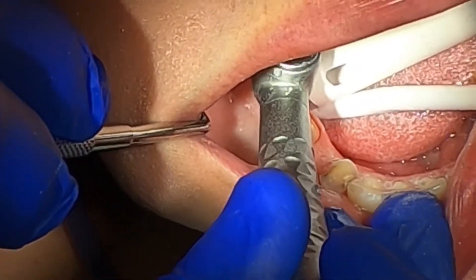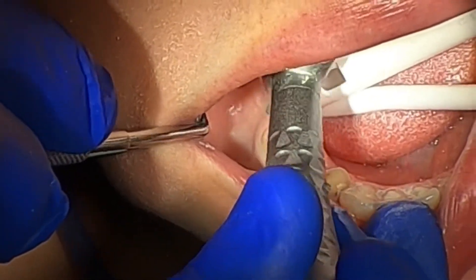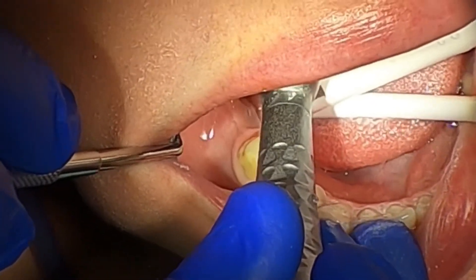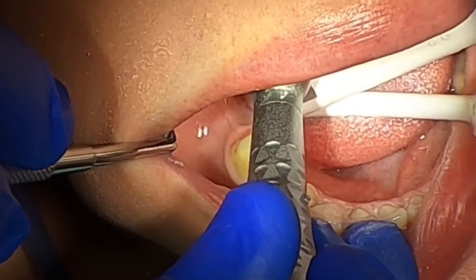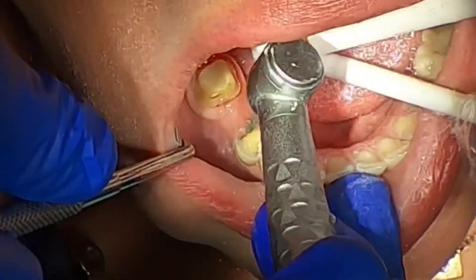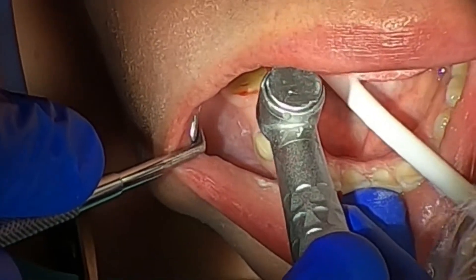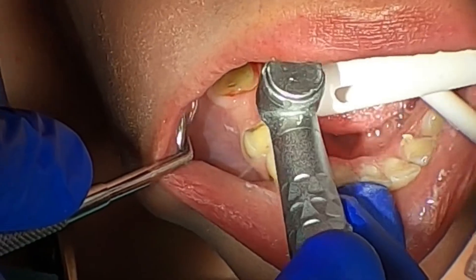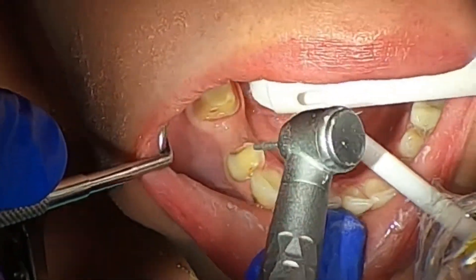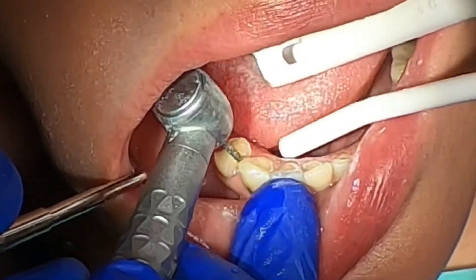Breaking it down: 15 minutes of anesthesia, then if you get started on the preparation at about the 30-minute mark, get all the scanning, imaging, and designing done by about the first hour including the preparation, you should be able to complete a bridge like this in less than three hours. I usually give patients an opportunity to leave — some are embarrassed or uncomfortable leaving with a numb face or with their teeth prepped down.